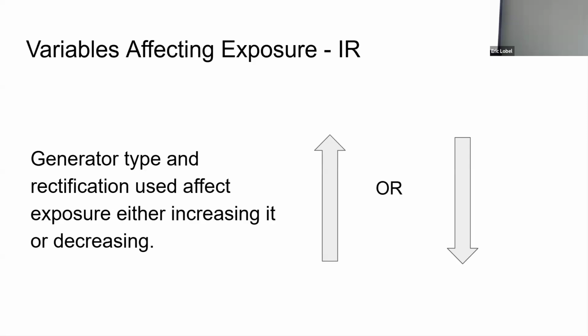Like, has anyone noticed that whatever pops up that most techs use, it's supposed to give you preset numbers, but those numbers should work. Maybe it needs calibration.